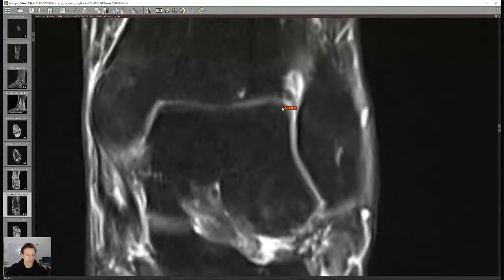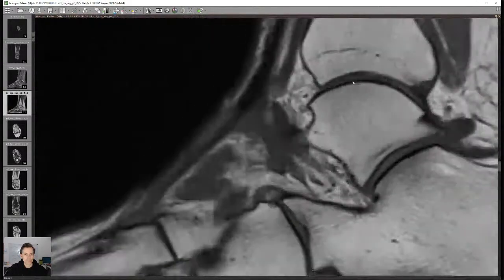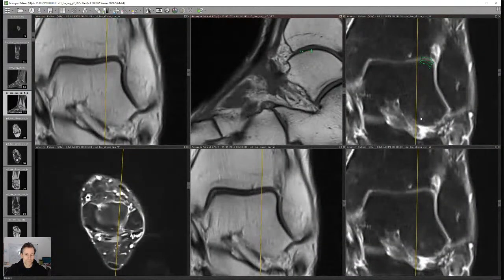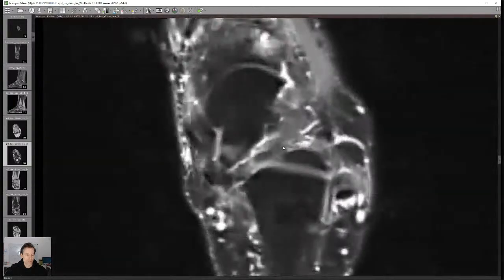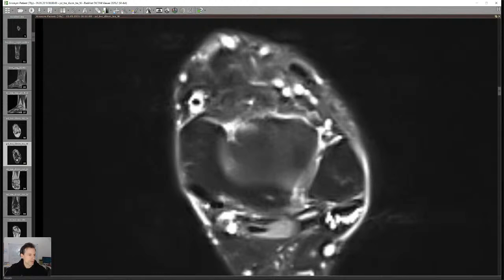I describe the depth of the defect too — sometimes for larger defects I describe that the cartilage defect goes down to the bone. I don't normally measure area unless it's a very specific study requirement. You could technically measure it with a free-hand tool but it gives too much information and is hard to standardize. I don't use classification systems — there are different ones and I'm not a big fan of grading systems; they're mostly invented for study purposes.